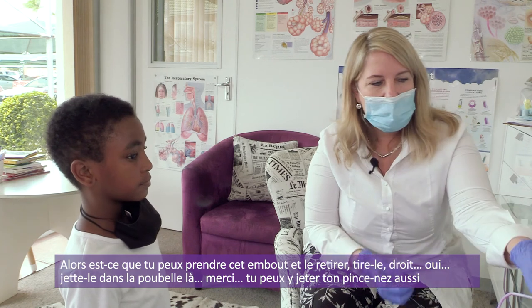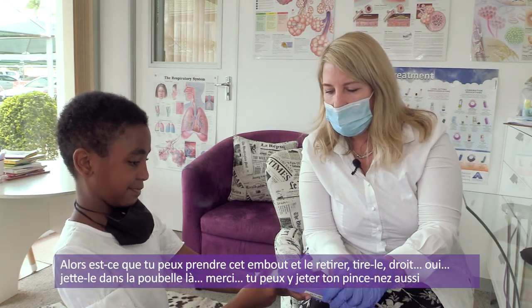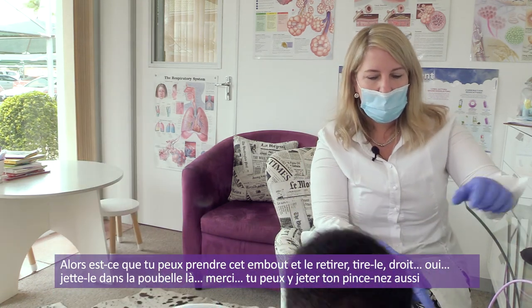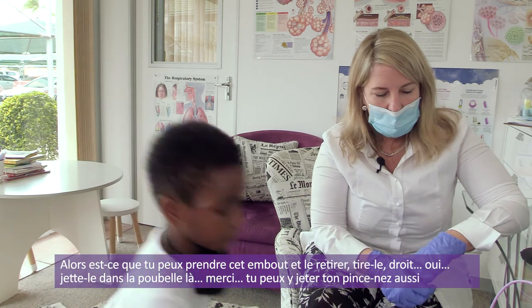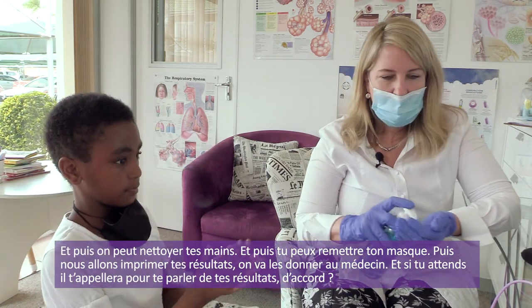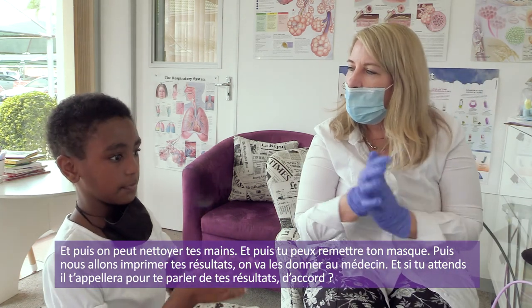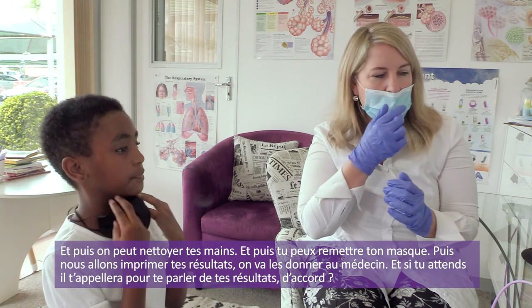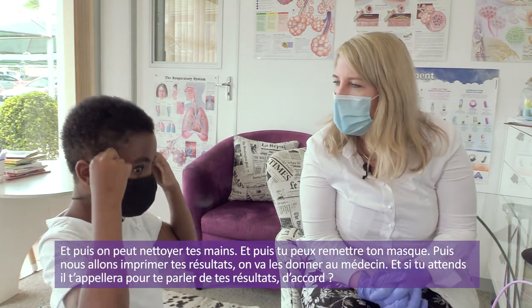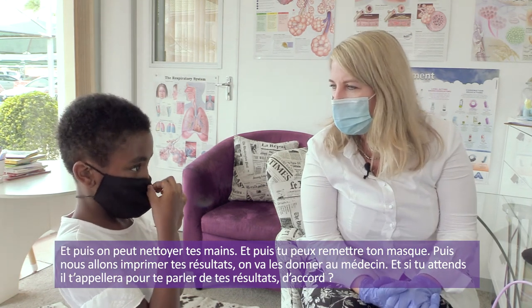So can you please now take this mouthpiece out? Just pull it straight. That's it. Throw it into the waste bin over there. Thank you. You can throw your nose clips in there as well. And if you can just wash your hands. Okay, and then you can put your mask on again. And what we're going to do now is print out your results, show them to the doctor, and you can just take a seat outside and he'll call you in to discuss the results with you.